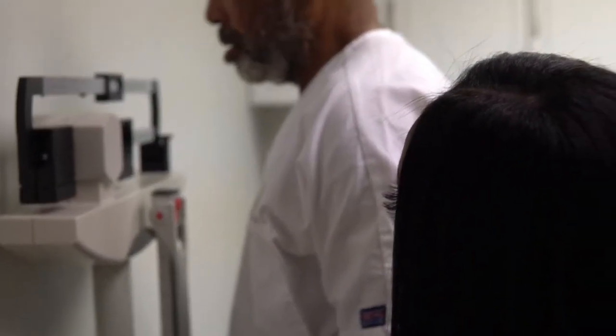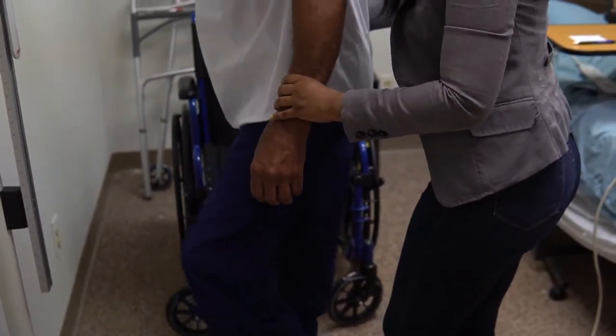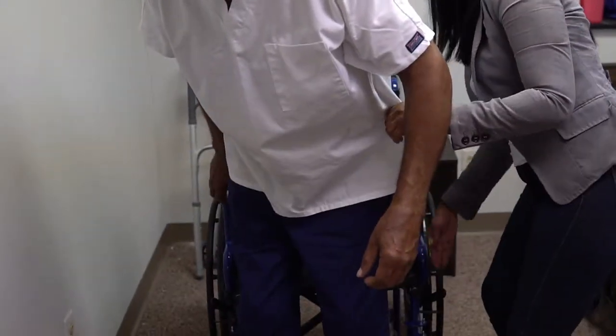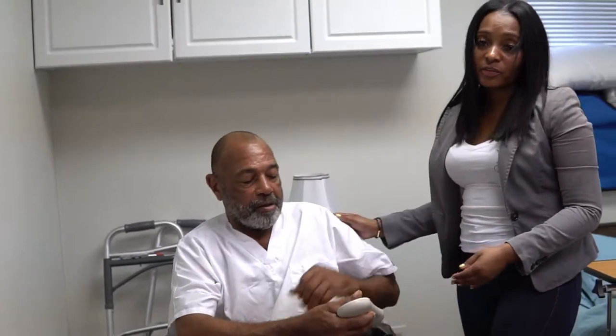Then you assist the resident to sit back in the wheelchair. Thank you, Mr. Bailey. You take a step back. You want to make sure the wheelchair wheels are still locked — they are. Have a seat. Are you comfortable? You always make sure your resident has their call light so they can reach you if they need to.